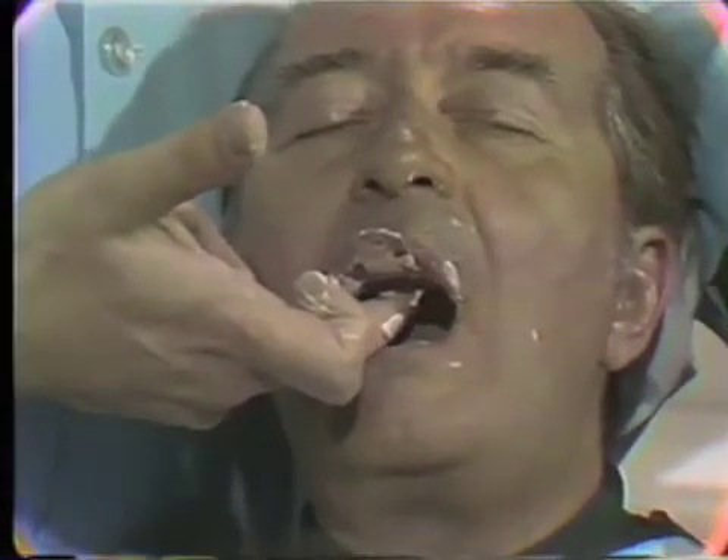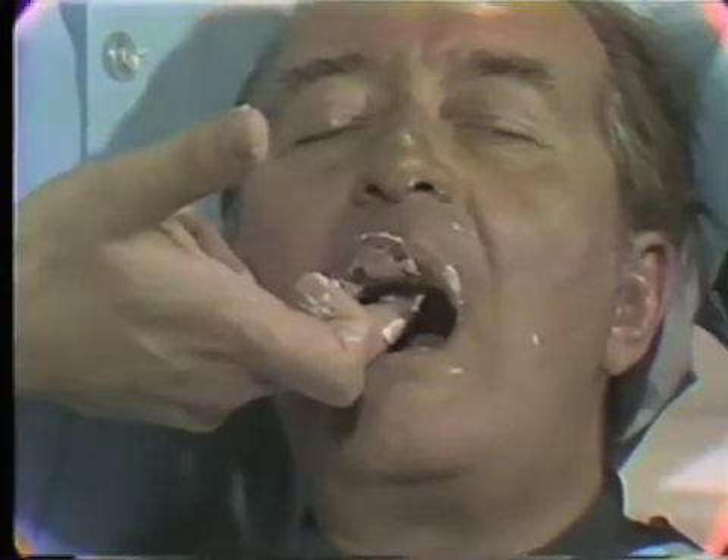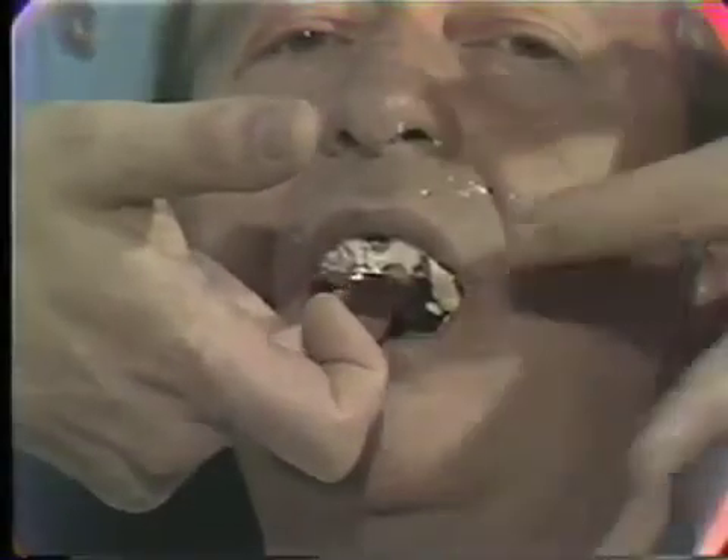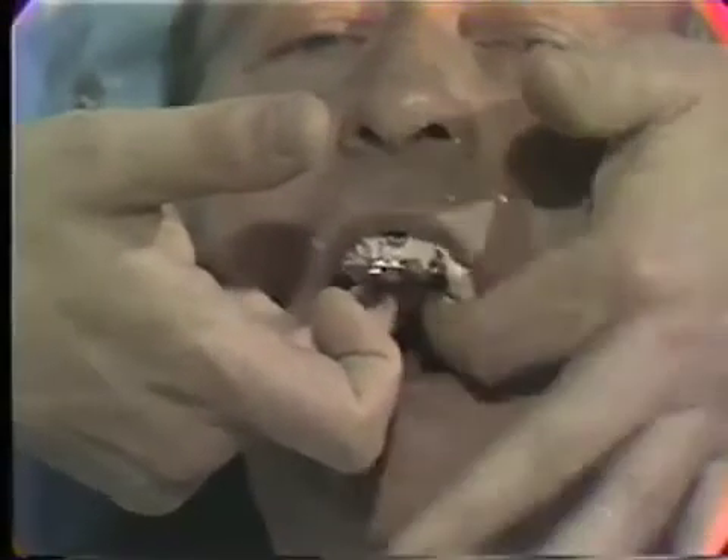Never leave the patient unattended while an impression is setting in the mouth. After the material is set, the tray is removed. The patient's mouth is inspected to ensure that the airway is clear.